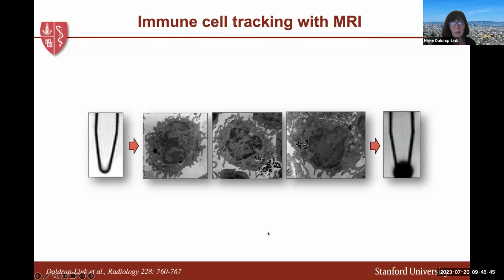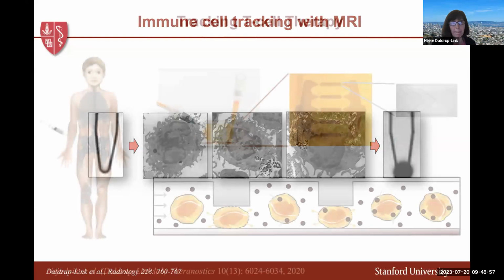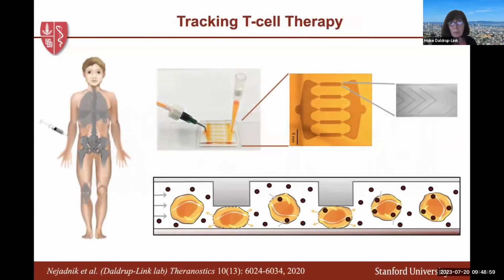For CAR T cells, we need some other techniques because CAR T cells usually do not show a high phagocytic activity. Here's one approach how we can label CAR T cells. We have collaborators from Georgia Tech University who developed this microchamber, and we applied it for our purposes.